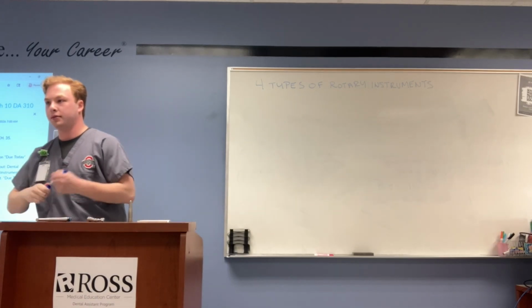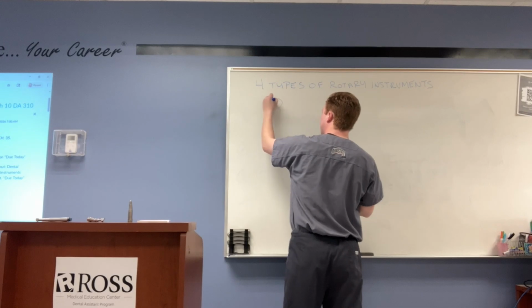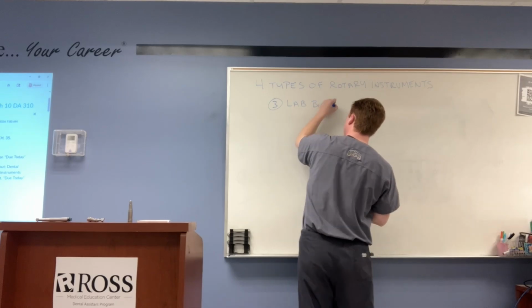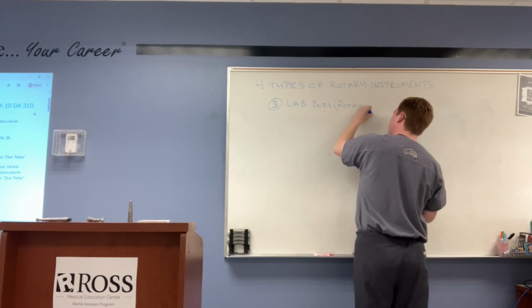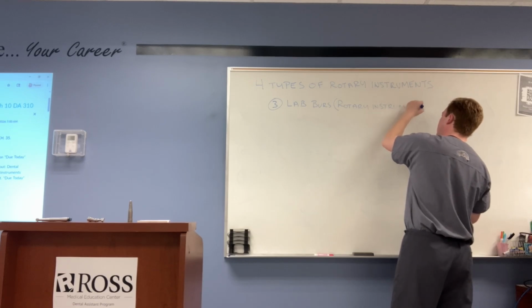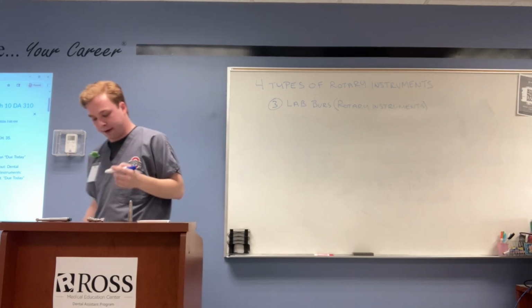So number 3, the laboratory instruments, or the laboratory burrs, labbers. These are used for the lab.